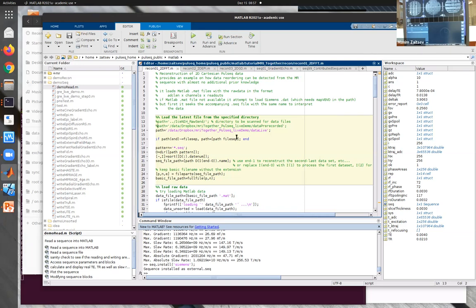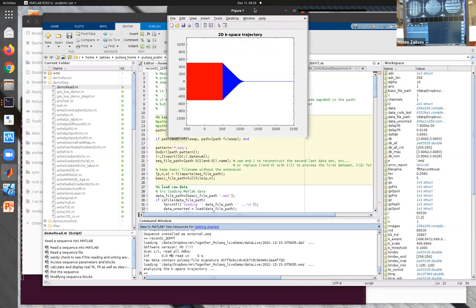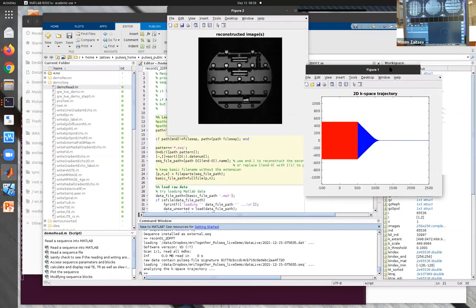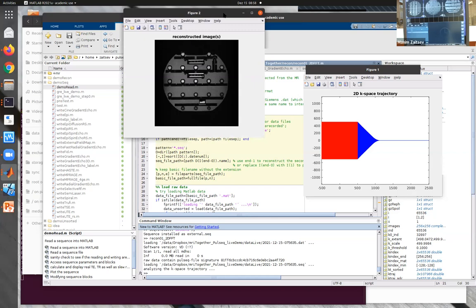So the way the script is set up, we say where it fetches the data from, it scans the directory for the files, and it's configured to reconstruct the last data set. If you want the second last, you can use -1. If you want the first, you just say 1 here, and you can go through the examples here. So we will now look at the last data set measured. That's our k-space trajectory, exactly what we did before, and that's our data. So that's the sequence we just ran a few moments ago.